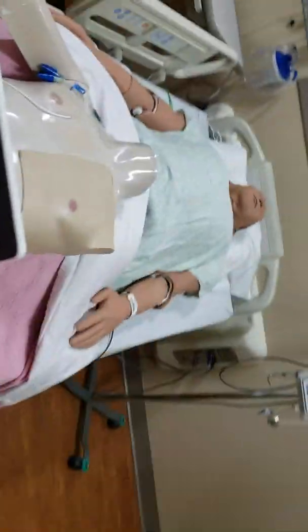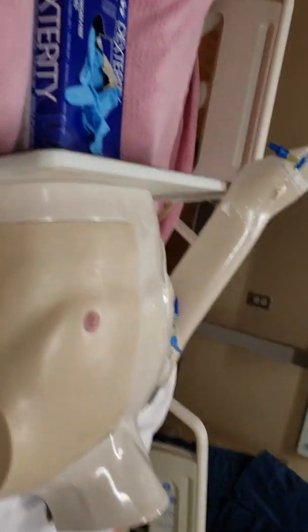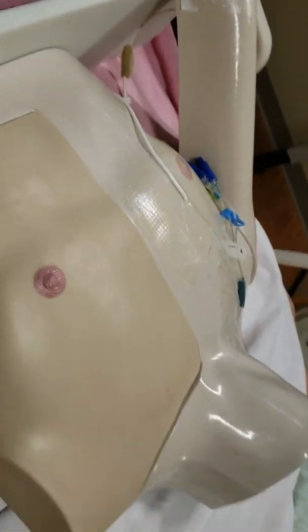Okay, I'm going to re-enter the room and the bedside table. And my gloves.